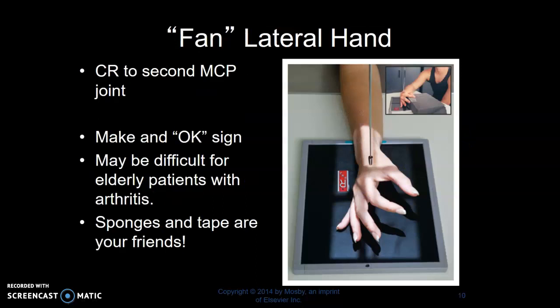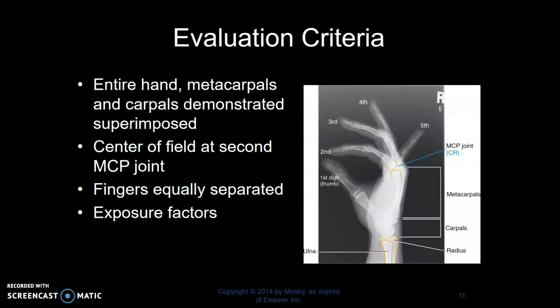Fan lateral. I ask my patient to make an okay sign, then I place them lateral on the board and separate their finger and thumb at the last minute. This may be difficult for elderly patients or patients with arthritis. If you have a support sponge, you can use that. Sometimes we'll have to use tape or gauze wrapped around to separate the fingers. To evaluate the lateral hand: ideally you want the metacarpals superimposed and you want to be able to visualize all of the fingers separately. Make sure you don't cut anything off with your shadows of light.